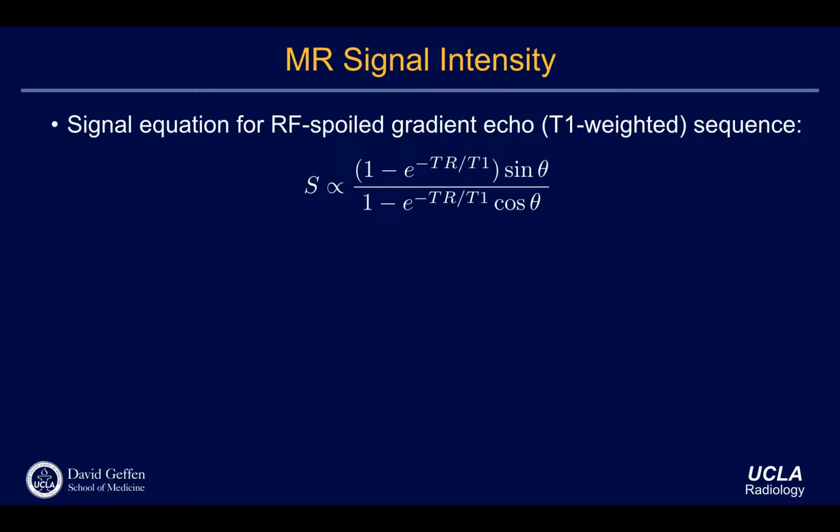All right. So the first one is actually how do we connect the relaxation changes and signal intensity? And back to the question related to why the signal is higher when the T1 is short, it is because of this. This is the so-called signal equation when you use an RF-spoiled gradient echo sequence. The signal will be proportional to this content. Okay? And you can see the TR is something that you choose, right? Whenever you run the RF-spoiled gradient echo sequence, you choose the repetition time, and you choose the flip angle, right?